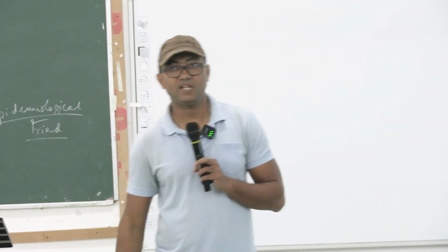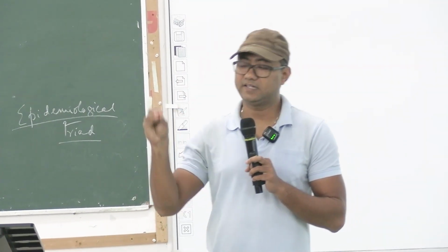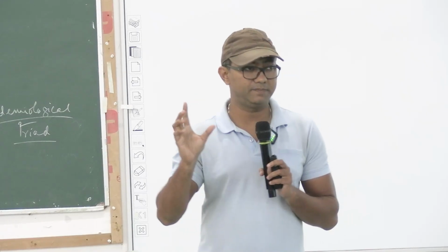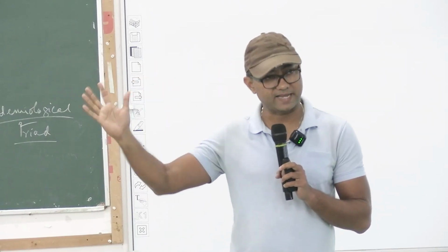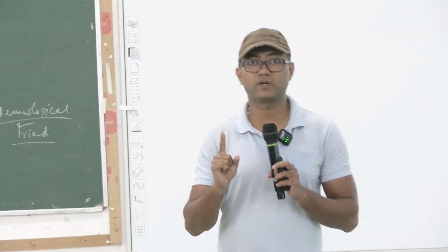The position of the ECG leads I will tell right now, but you will apply the ECG leads in your practical classes. To recap, there is a red color clip which we apply on right wrist, red for right. There is a yellow clip of the machine we apply on left wrist.